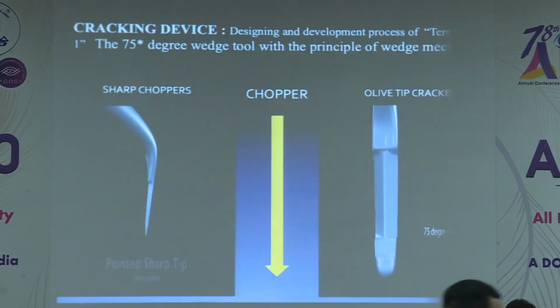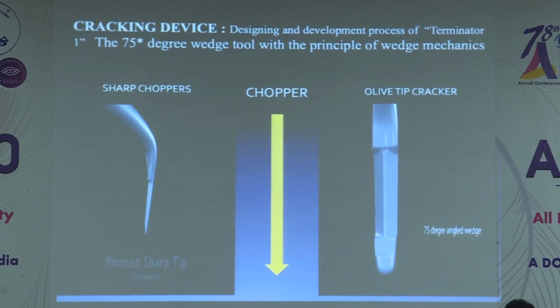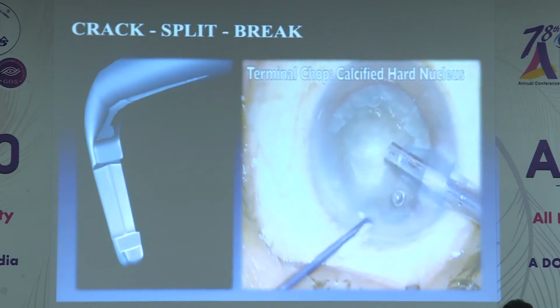Because in terminal chop you have to hook the nucleus. You hook the nucleus from the equator, and while hooking the nucleus you have to have a round tip. If you have a round tip, it will never hit the posterior capsule. It will never threaten the posterior capsule. You will never have posterior capsular damage, because it's hooking around, and then this wedge design will crack the nucleus. So you can see here in this video how it cracks.